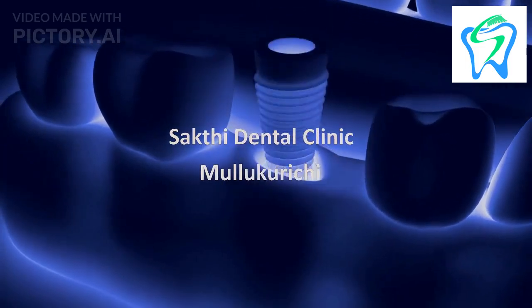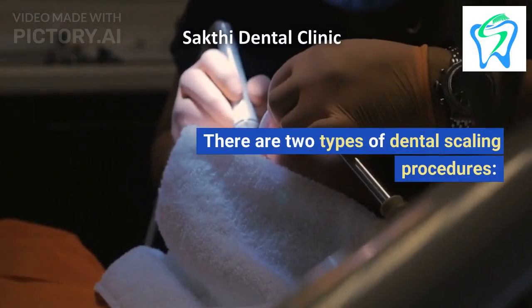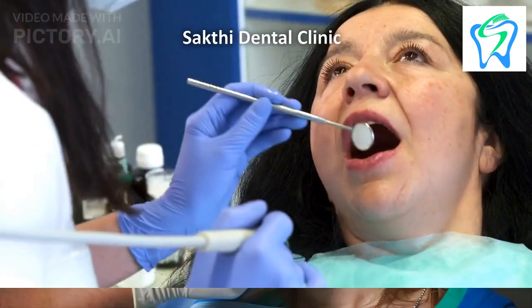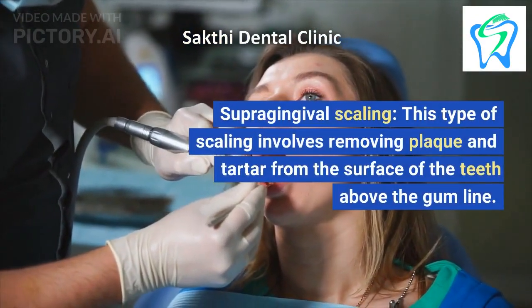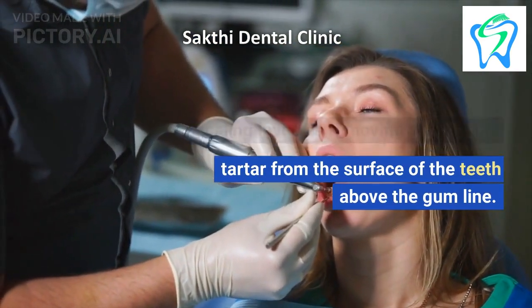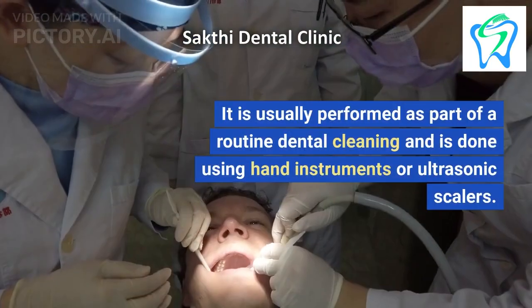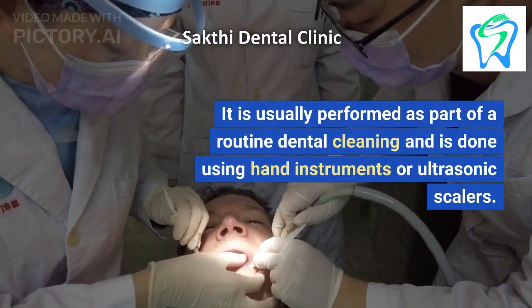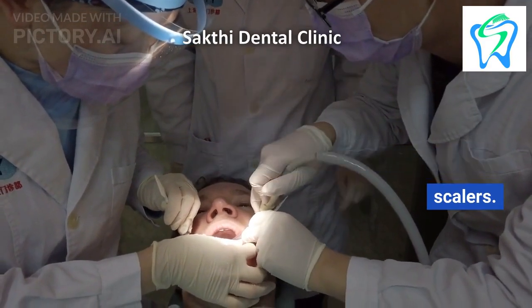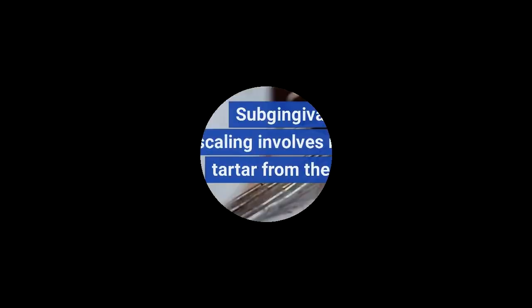Sakthi Dental Clinic, Mullukurachi. There are two types of dental scaling procedures. 1. Supragingival scaling. This type of scaling involves removing plaque and tartar from the surface of the teeth above the gum line. It is usually performed as part of a routine dental cleaning and is done using hand instruments or ultrasonic scalers.